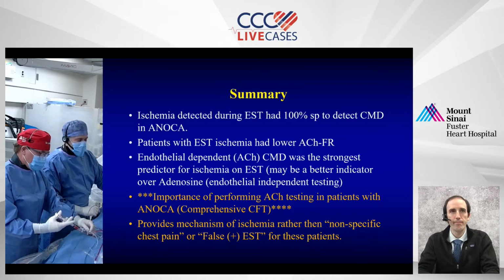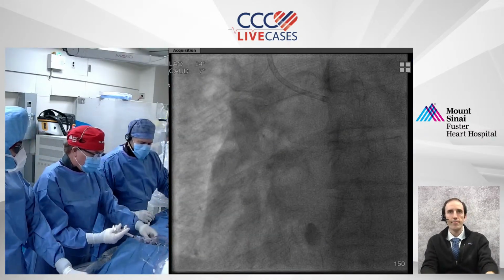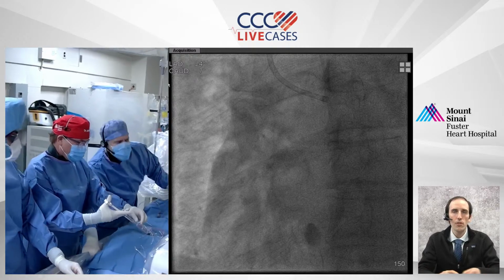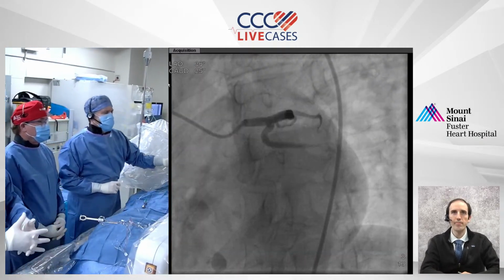Great. So with that, I think what we'll do is we'll move to our case. So I see you have a guide up already. Yep. So what we did is we started with a basic angiogram.